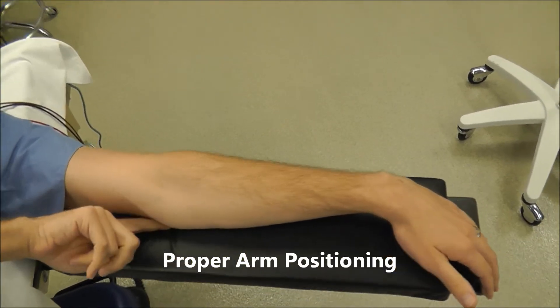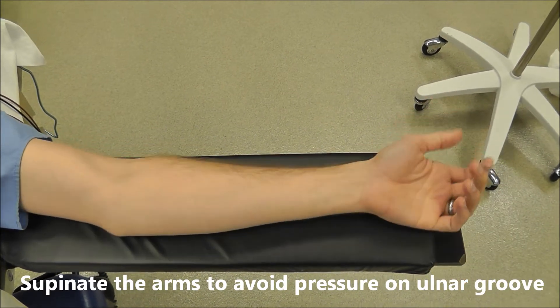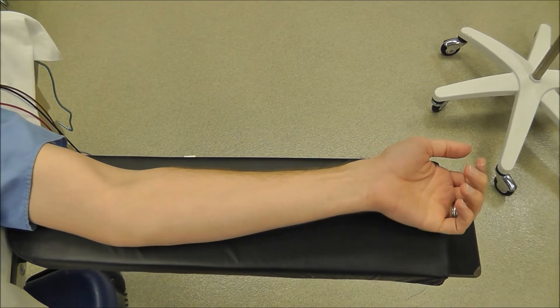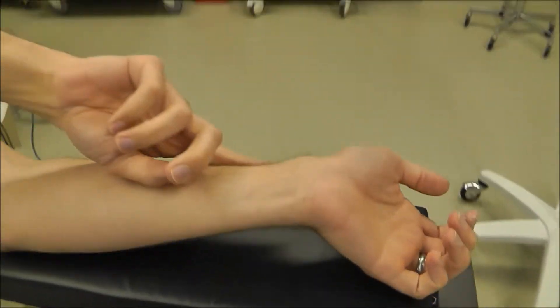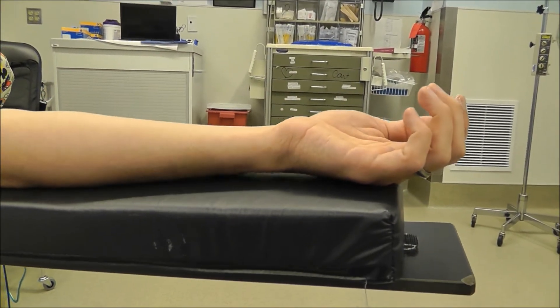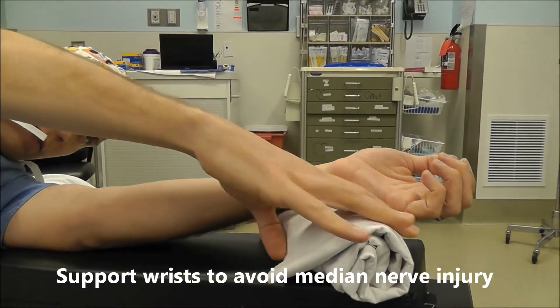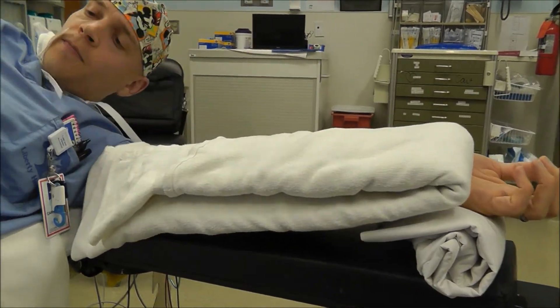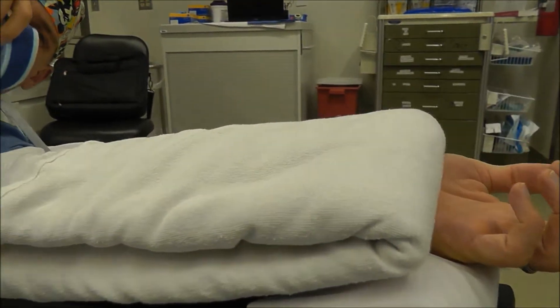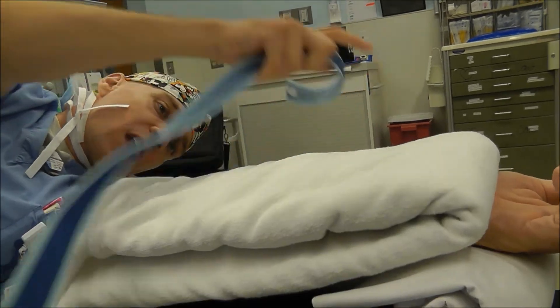There's pressure on my ulnar groove there. So whenever you position someone's arms out to the side, you have to supinate the arms — that's the number one key. And a lot of times with people that have bigger muscles, their wrists are kind of hanging. If their wrists are hanging in the air like that, you've got to make sure that you get some sort of padding underneath the wrist, so the wrists aren't hanging down. Then we get some kind of blanket up here like that, and then we go ahead and strap it down.